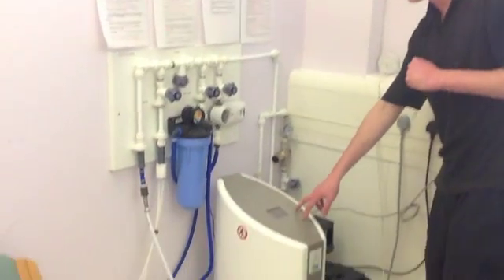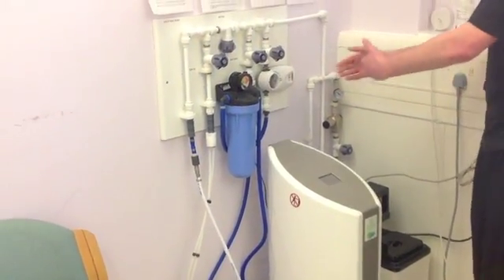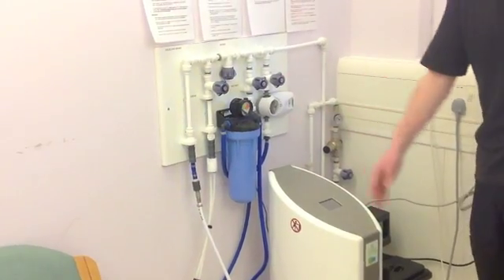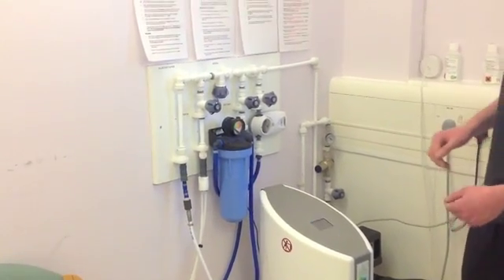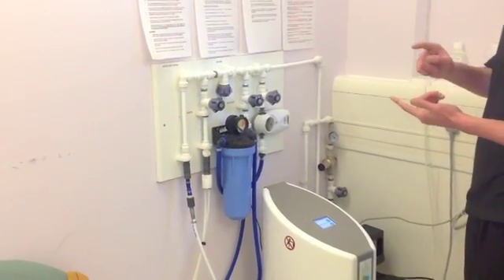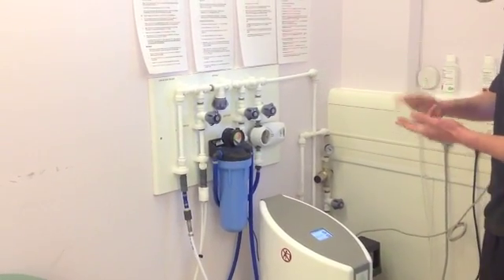Now the RO unit stands for reverse osmosis, which effectively means that it purifies the water so you get ultra clean water coming into your dialysis machine. This needs to be cleaned once every two weeks with either ROCLEAN 2 or ROCLEAN 5. We would like you to alternate them, but it is not vital that they are.